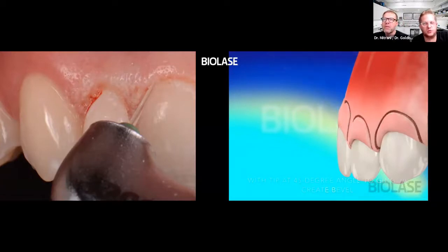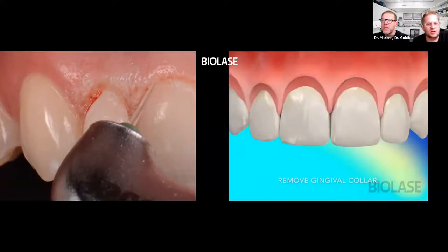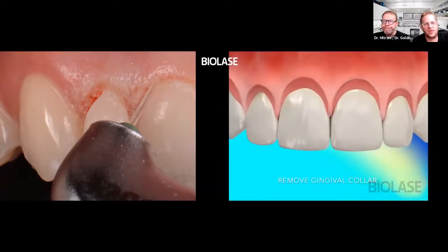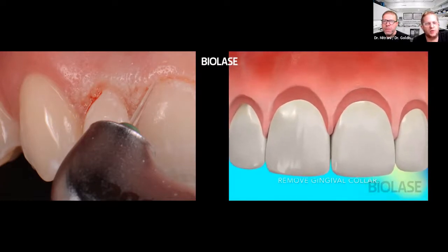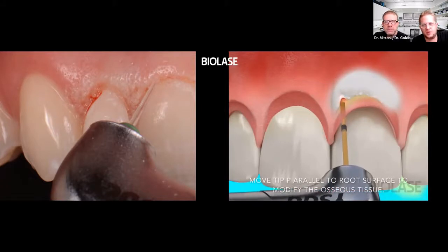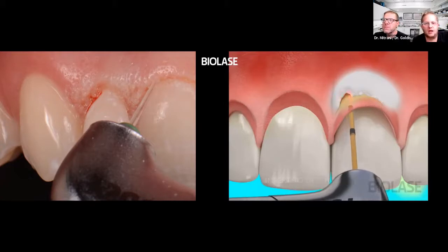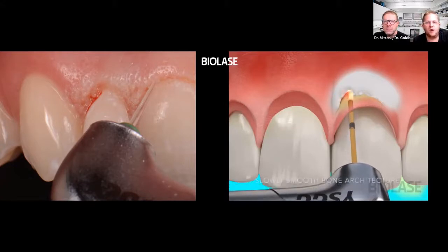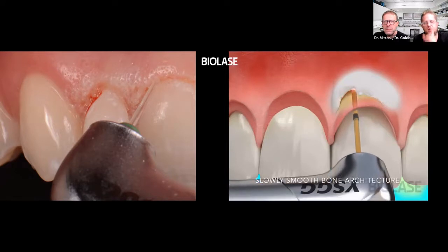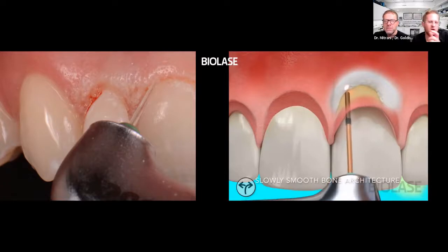That means that we're able to do this closed crown lengthening with the same laser. We're just changing the tip in this case. So we're starting with the MT4, which is a very thin tip. And then when we go to the bone, we're going to change the parameters a little bit and change to an MZ6, as we're showing in the animation right now, to go in and remove that bone. You can mark your tip where you want the depth to be. As Ricardo was saying, you check with a probe, and then you can mark the tip, or you can keep checking with the probe, whatever you feel comfortable doing.